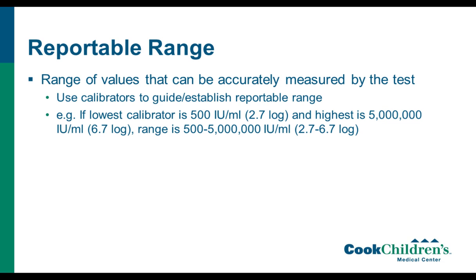The reportable range is also required for both FDA-approved and FDA-modified LDTs. And this is the range of values that can be adequately or accurately measured by the test. And so when you're using your calibrators, that's really going to help guide or establish your reportable range. You want to stay within kind of the highs and lows of your calibrators.